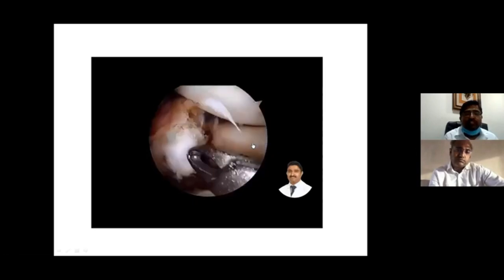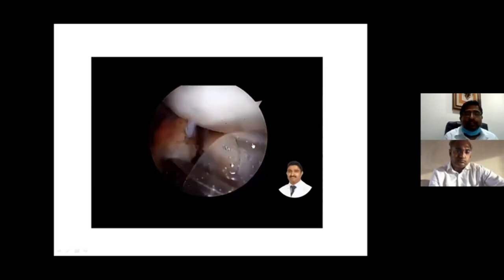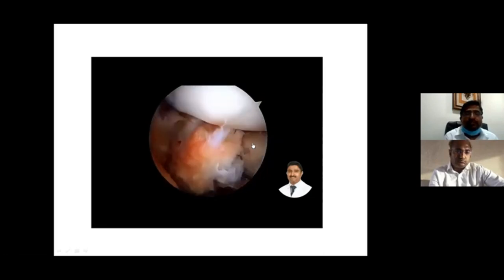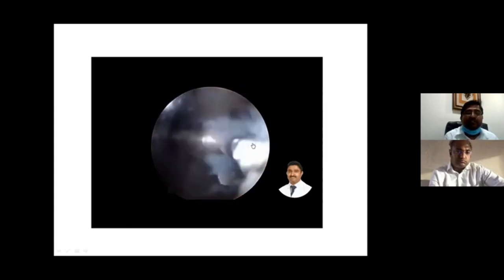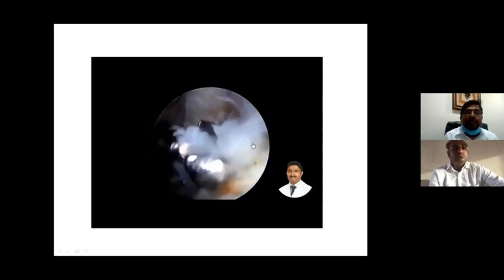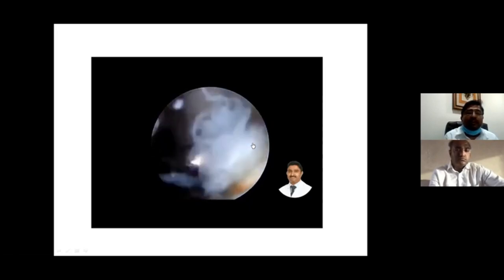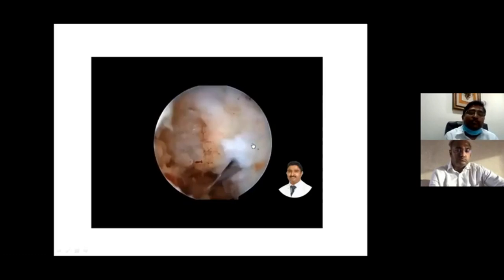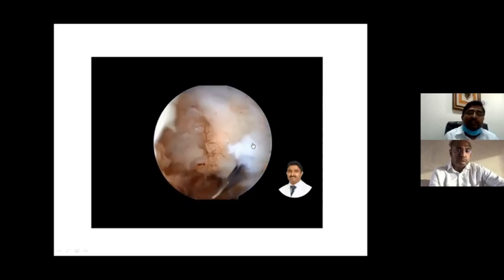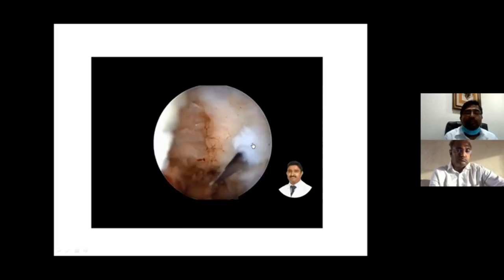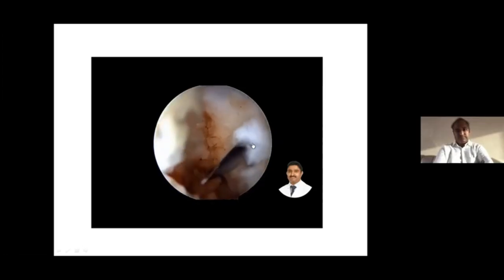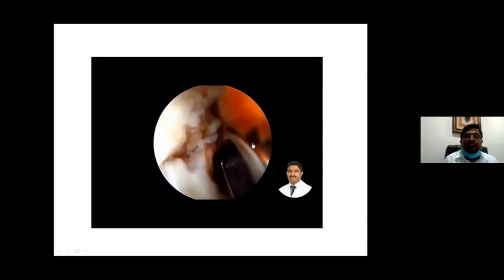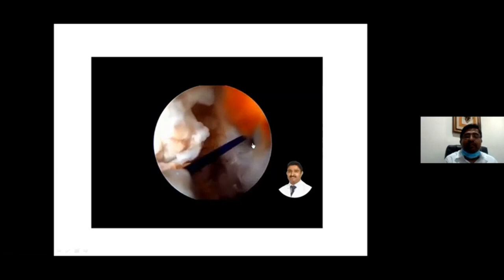Preparation of the bed is very important. Use a shaver or radiofrequency to get a healthy, bleeding bony bed. Once the fragment sits properly in its bed, use the standard PCL jig, placing it approximately 12 mm from the joint line at the bed level. Drill with a 4.5 mm drill bit through the tibia, then pass a spinal needle to the prepared bed and thread a PDS wire through it.